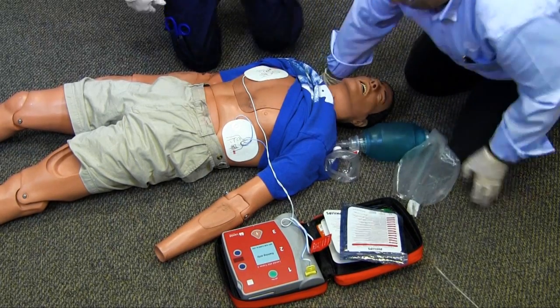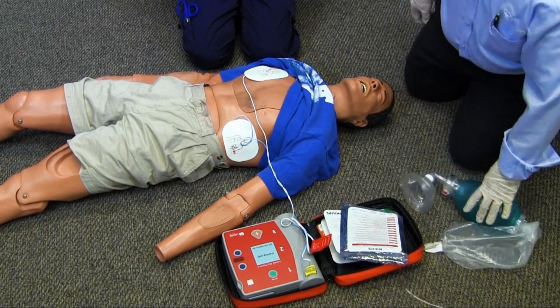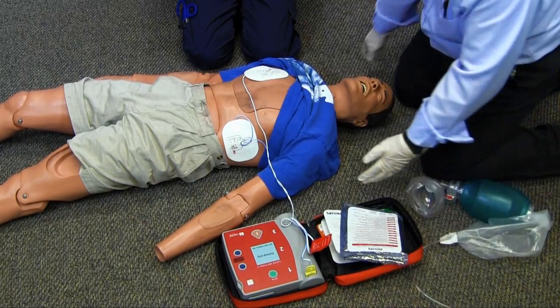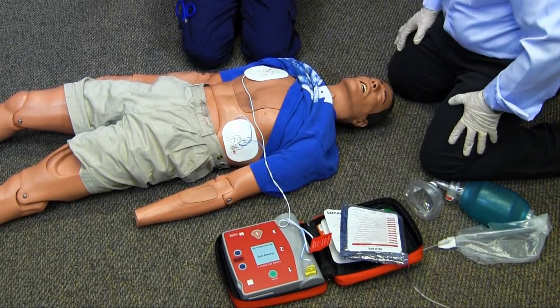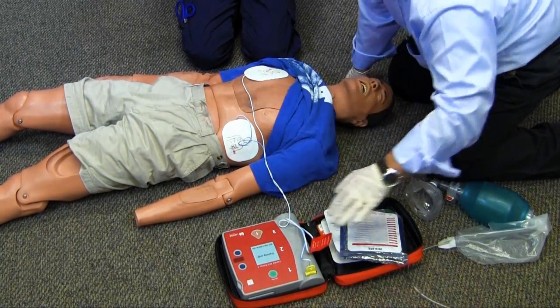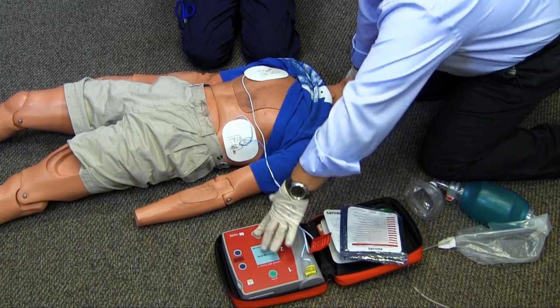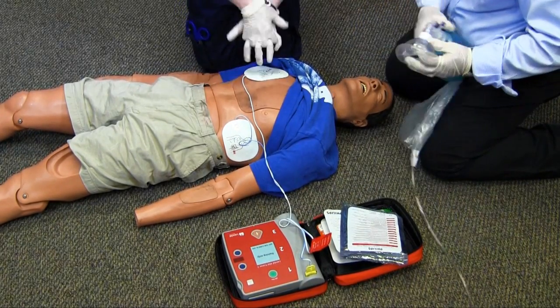If a shock is advised, I will ensure that all personnel are clear of the patient and deliver a shock from the AED. Once the shock is delivered, I immediately direct my partner to resume CPR.